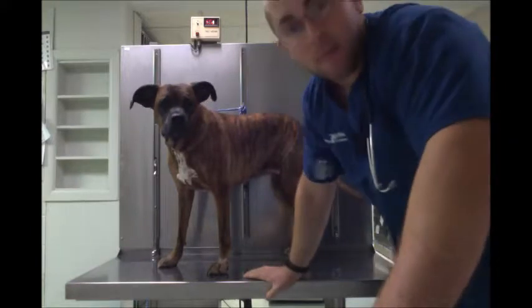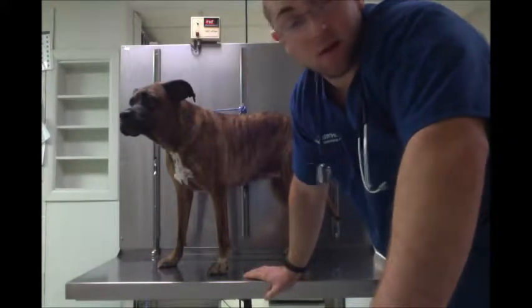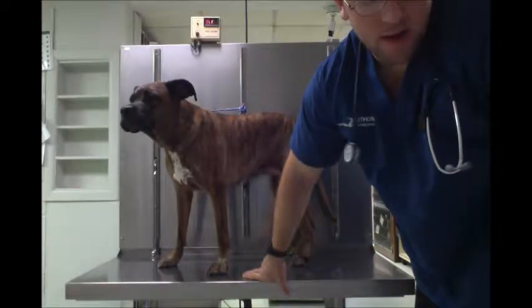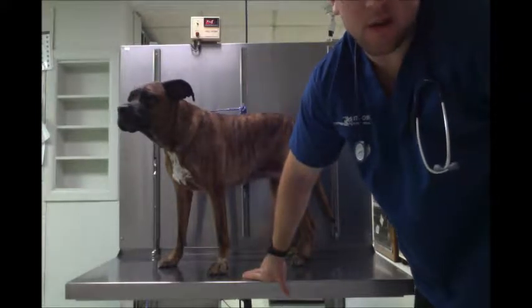Okay, so I got 30 beats in that 15 seconds, so we multiply that by 4 and you get 120, which is a very good heart rate. And I didn't hear any problems with her heart or lungs, so I'm going to give her an ASA grade of 1.